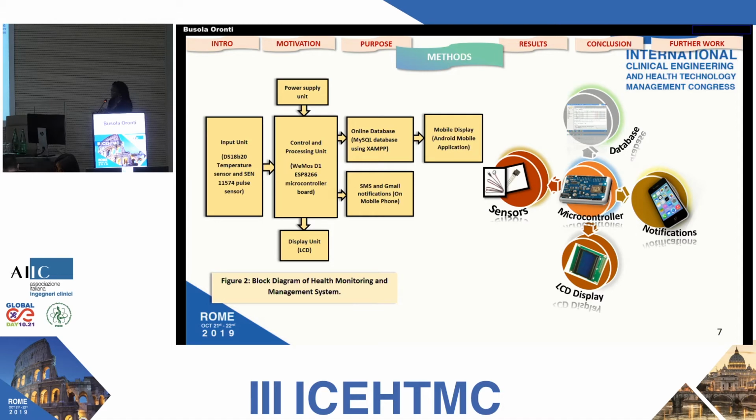Now, the microcontroller is the core of the whole system. It provides output to the LCD, and then we have the online database where the measured data are stored, and then it also generates the SMS and Gmail notifications, which are sent to the mobile phone. And then finally, the Android mobile application, which resides on the mobile phone of the health practitioner and the patient under consideration.